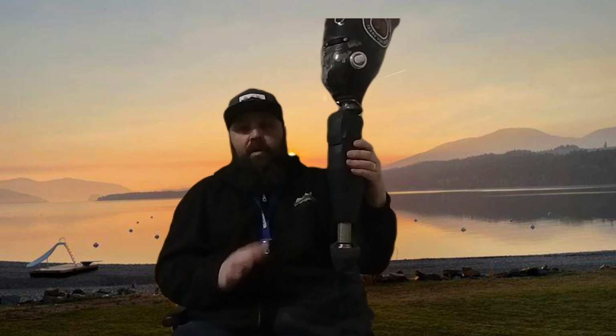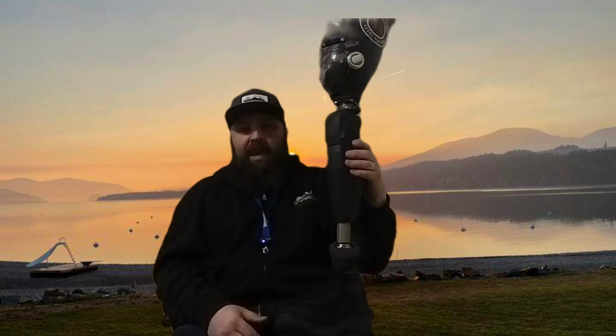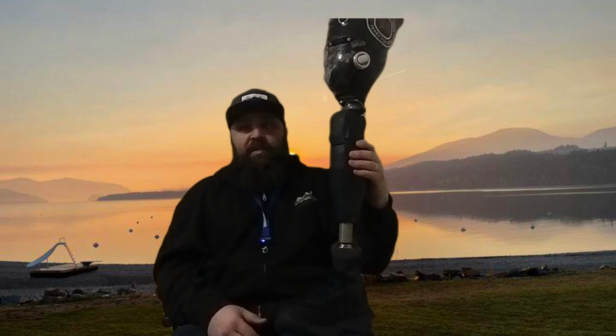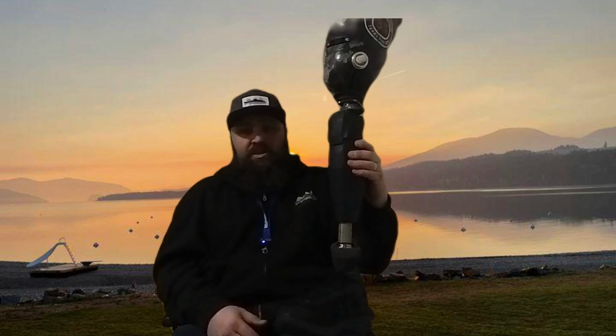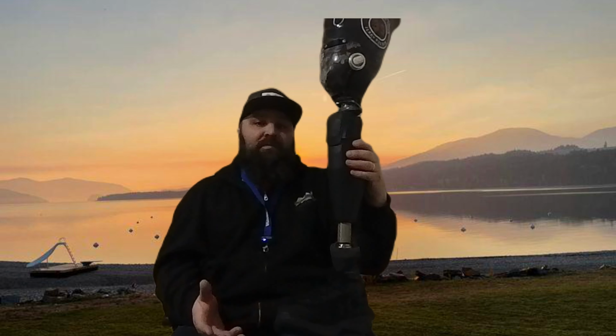It just doesn't have the waterproof feature, which would be nice to have, but I can't really justify it with WorkSafe. Like, I don't work in wet conditions. Yeah, I'd love to swim in it, but I do have a swimming leg too.